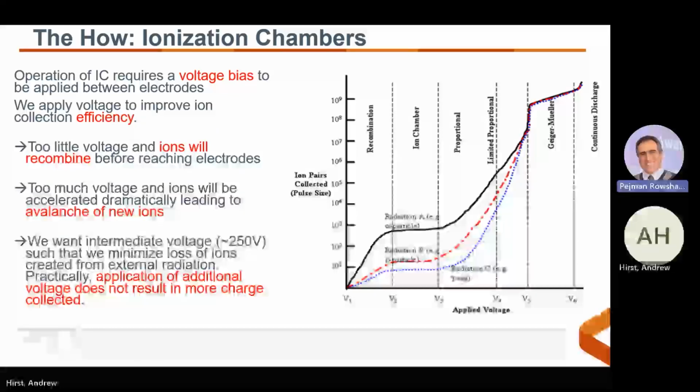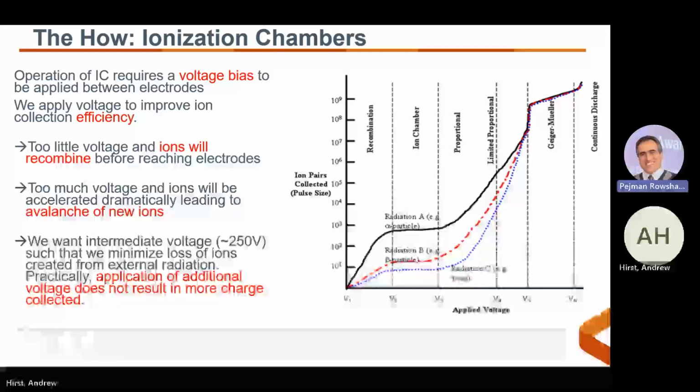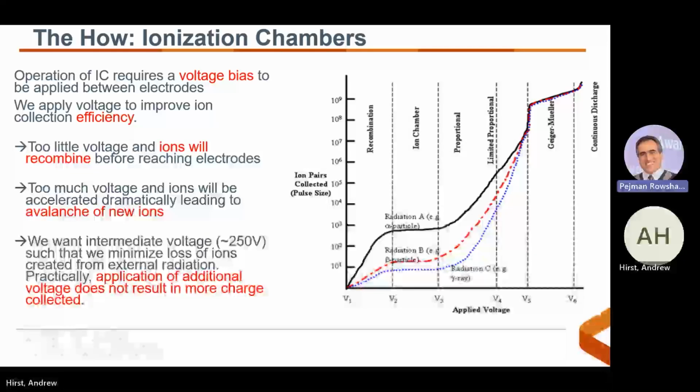Brani, I just wanted to say also with this graph, it's a good one to know for your studies. You might get exam things coming up. This one's really important to know for how ionization chambers actually work and the difference between the dosimeter and survey meter. So it's a good graph to know. Make sure you understand that one. Andrew is leaking examples. I haven't seen the exam, but if I made an exam, that's what I'd put on it. But he's right, yes. This is a really good graph to know. And if you don't understand it, definitely go look it up in a textbook and make sure you understand that one. Absolutely, Andrew's spot on with that one.